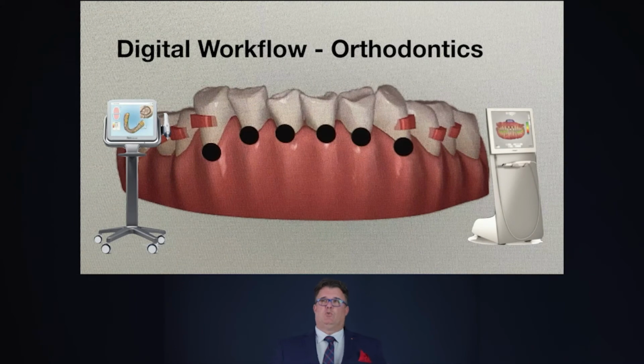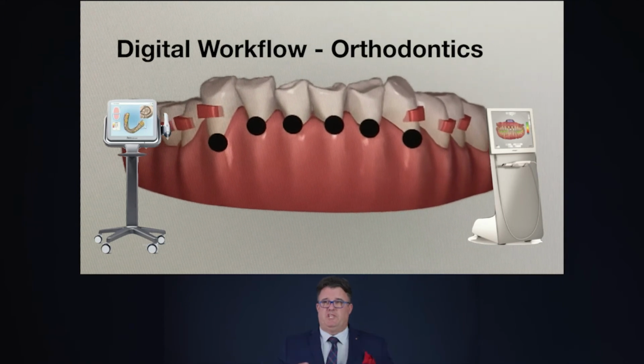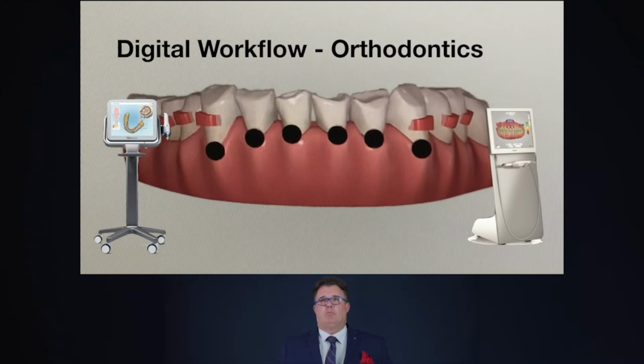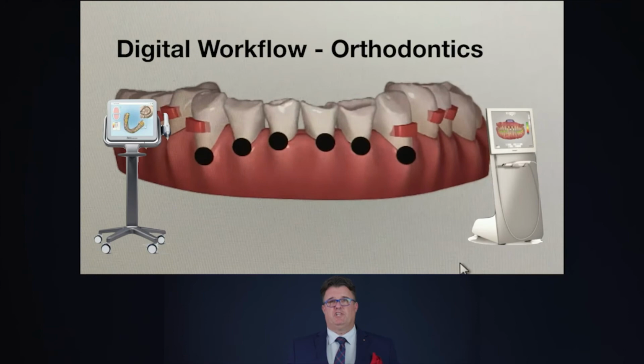Or we can go digital workflow for orthodontics. We can see that in this case the orthodontist wants to intrude the teeth. So you can take a scan, plan this, send it off. I know people are very familiar with this. It's very easy to do, a lot easier for your team.